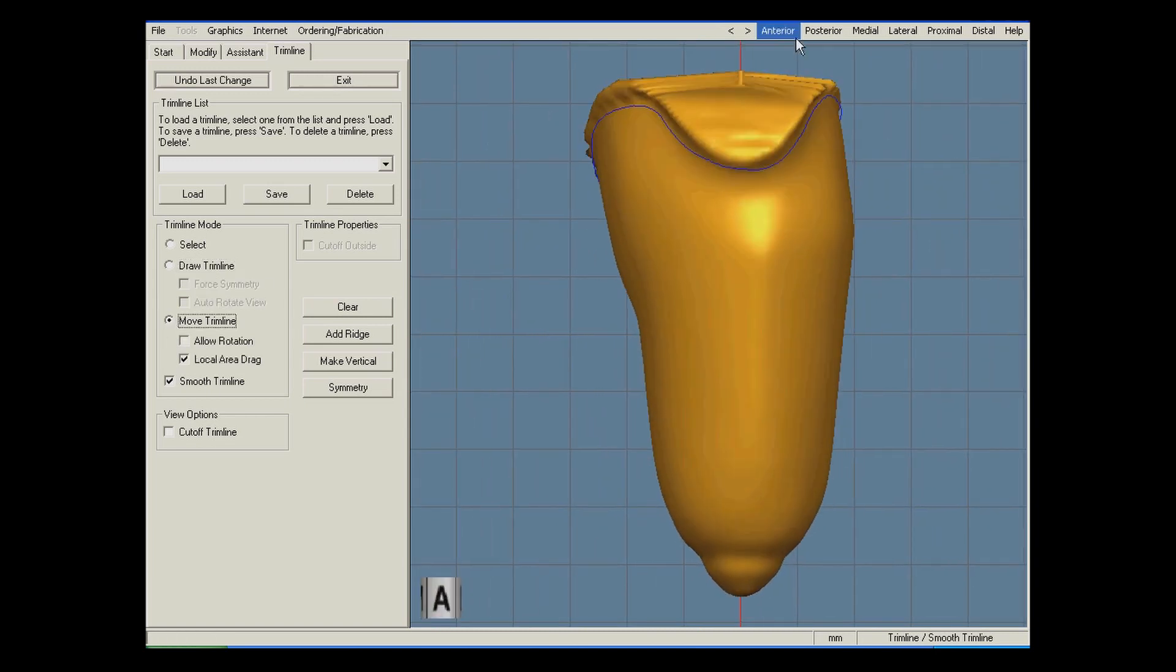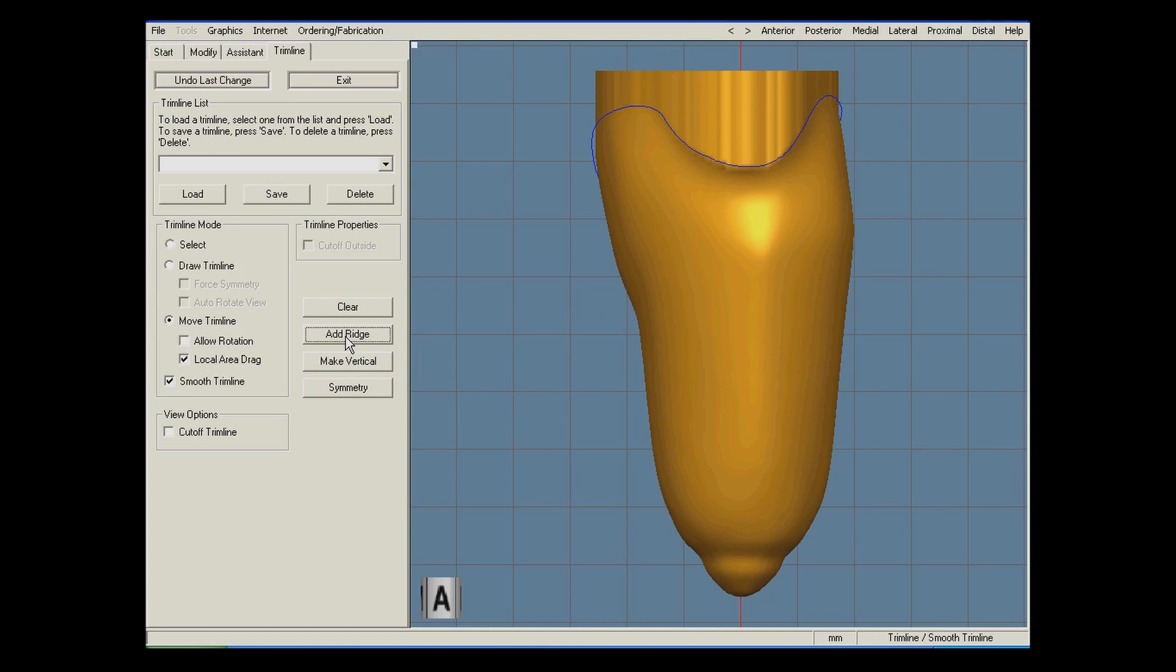Now that I have the trim line where I like it, I will use the make vertical function to open the proximal end of the socket. Then, I will add a ridge to pronounce the trim line so it is clearly visible when printed.